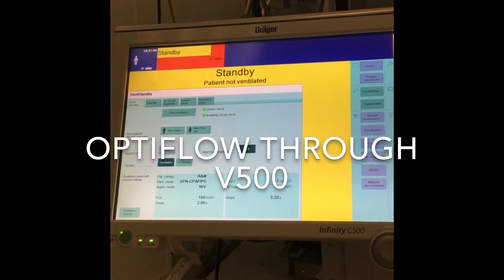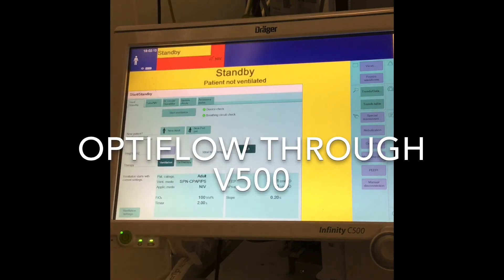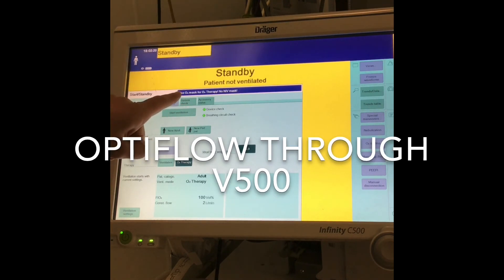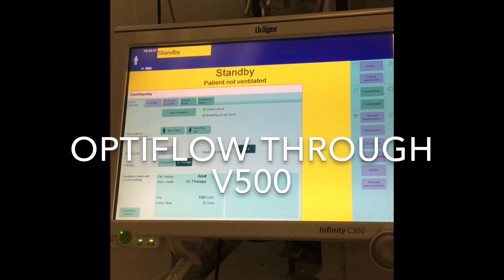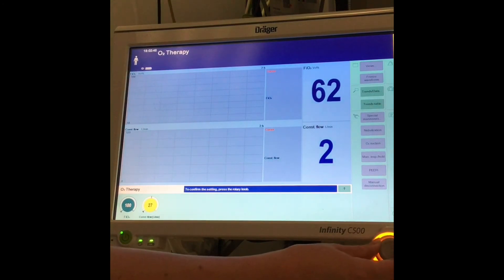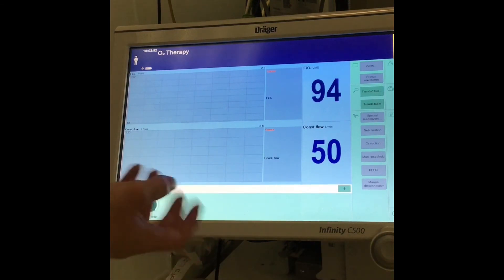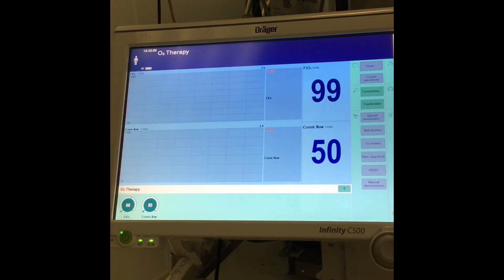Now for OptiFlow: it has to be a warm humidified circuit to use OptiFlow through the ventilator. From the main front screen, select O2 therapy and confirm it with the dial. There's a warning which says use O2 mask for O2 therapy and not NIV mask, so connect your normal OptiFlow either nasal cannula or trache connection. Hit start ventilation. At the bottom you've got your litres per minute — it only goes up to 50, whereas OptiFlow goes up to 60. Then tweak your oxygen as you normally would.